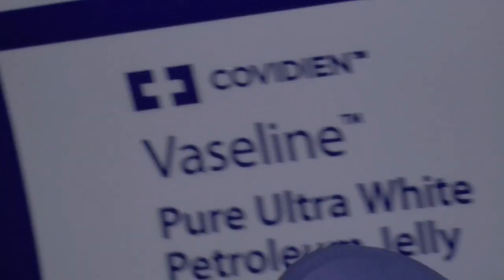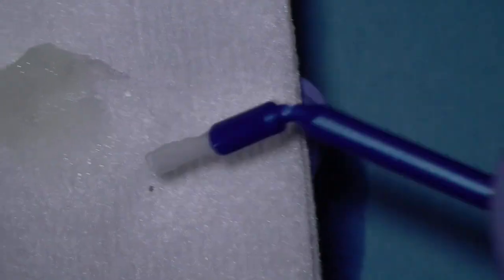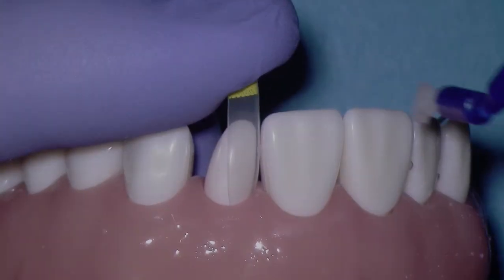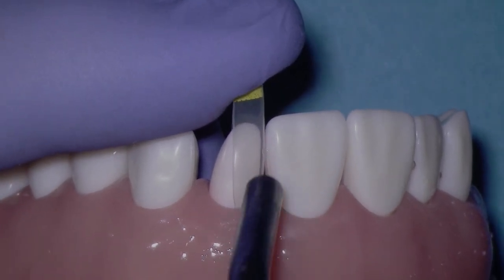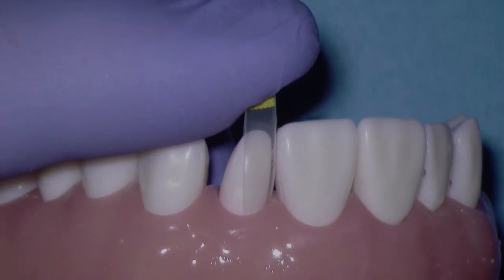Step number 2, we're going to take some lubricant. I'm going to be using Vaseline, and we've got a little bit of Vaseline on this little bender brush. Let's take a very small amount. I'll continue to hold the matrix in place and gently wipe just a bit of lubricant on the neighboring tooth where the contact is going to be built. While we're still holding the matrix in place, I'll go ahead and air thin that Vaseline.